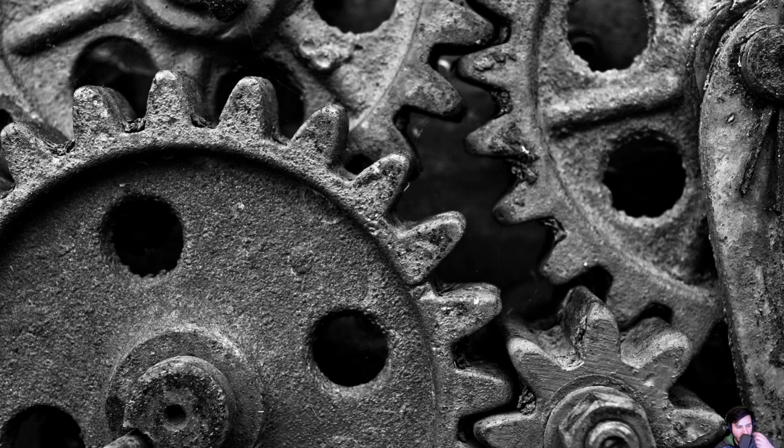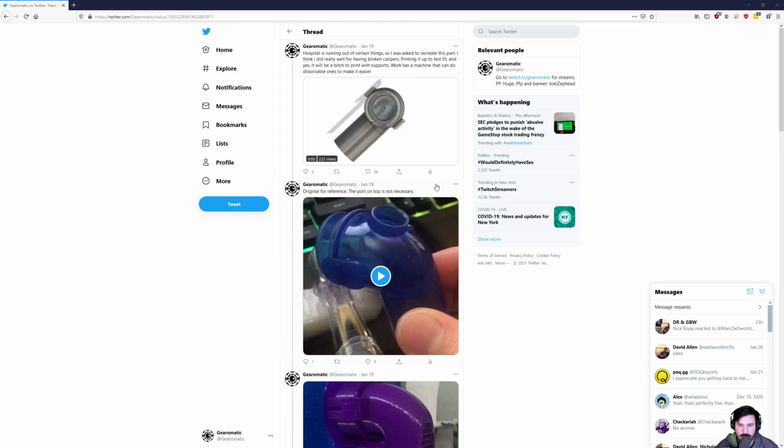I'm gonna do a quick recording here talking about a little piece that I made. Basically, it is an adapter. I have a failed print here of it, and I'll show it in a second. Actually, I could show it now. There's no reason not to. It is an adapter. This is the original one here. This is the one I had initially modeled up, but not the final one.